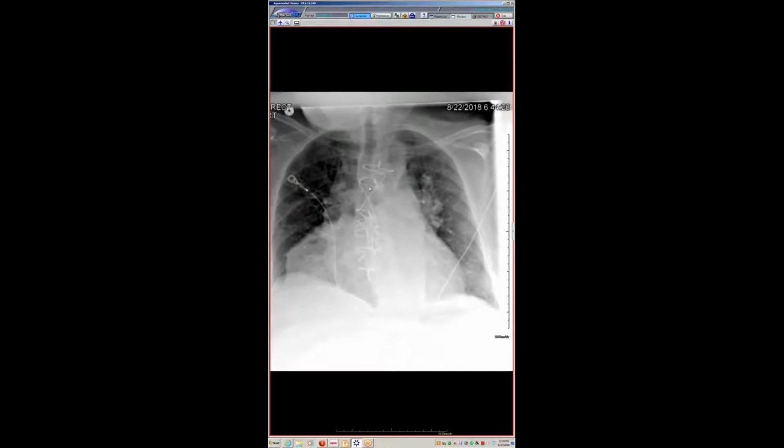I think here you could say, okay, the patient's had a bypass. It's in the differential diagnosis, as are other cardiophrenic angle masses. But there are some cases where you look at it and you're like, that's a bypass graft aneurysm. Exactly, especially if you have a prior radiograph to compare to that shows slow growth over time. We've had a few where over the course of years you see it slowly enlarge, but it's certainly something to include, like you said, when you have a prior median sternotomy.